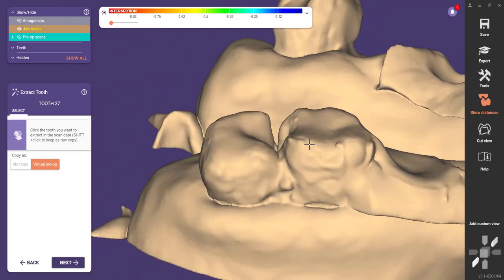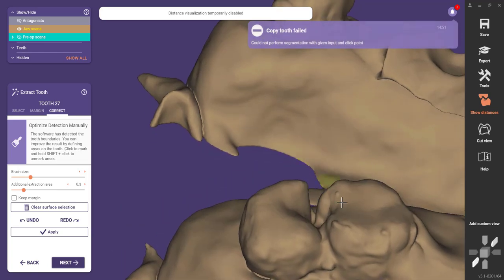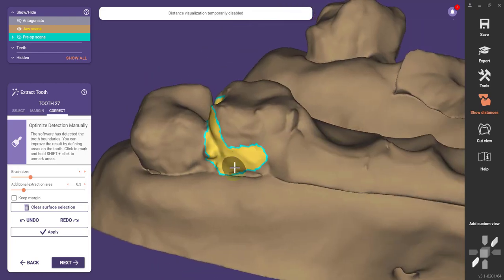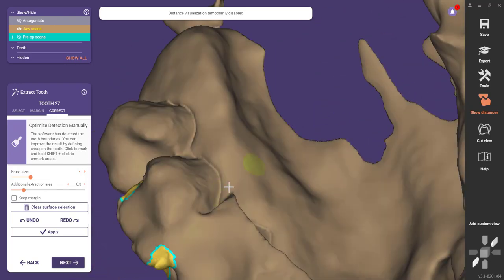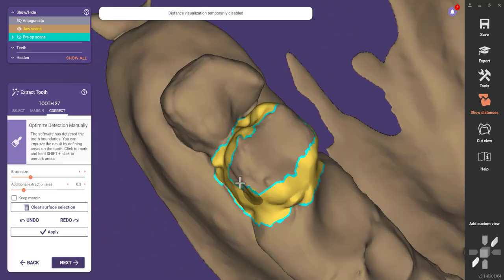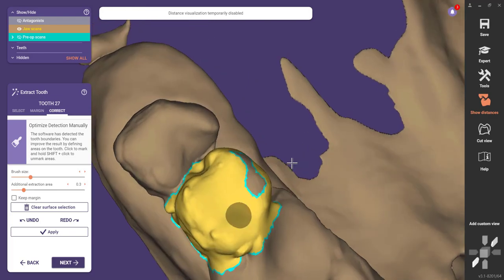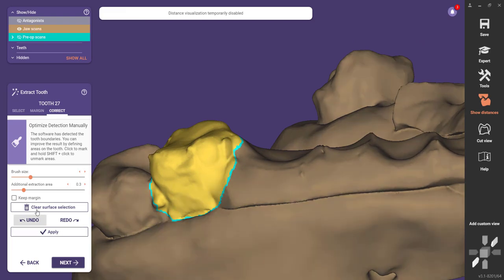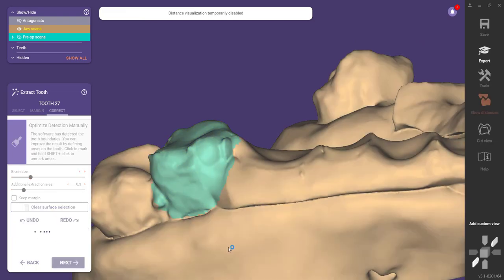Now we're going to do this last tooth. After I did that correction of my margin earlier, from that point forward it really started to not be able to read these teeth automatically. I don't know what's up with that — sometimes these things just do weird stuff. So what I've been doing since then is just manually outlining these teeth. I'm not trying to be super careful with this. Really all I'm after is a model that doesn't have these teeth on it, but I would kind of like to see the indentations of where those teeth would have been. So we'll click Next and now that aspect is done.